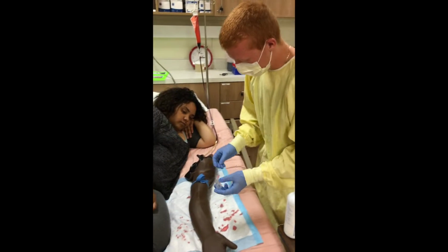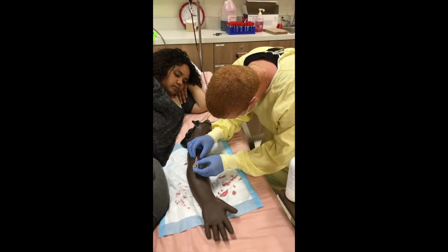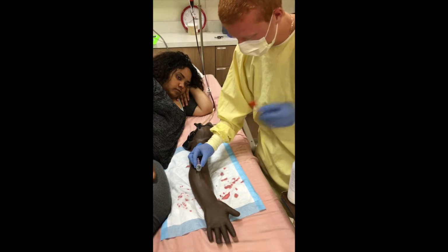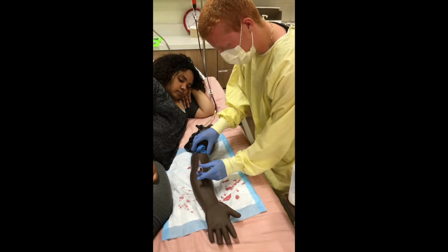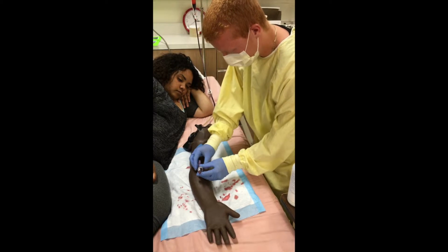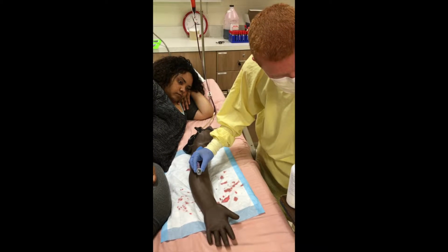Then you're going to gently insert into the vein. You should be able to feel it as it enters. And then begin blood collection. When you're done, remove the vial and put it away.